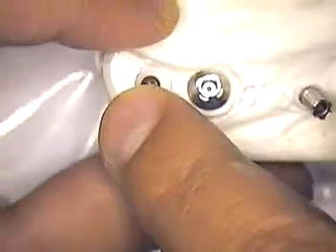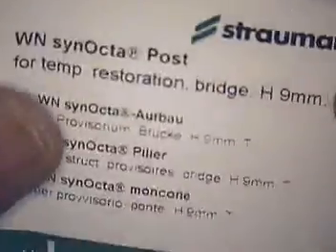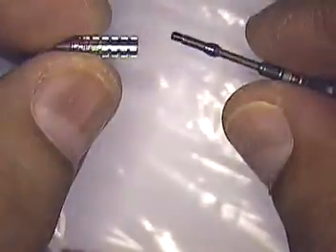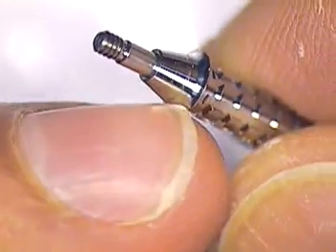I ordered the parts. These are bridge temporary abutments. When you receive your temporary abutments, they come in a container like this. This one happens to be the RC for the bone level temporary abutment for the bridge. I'll also show you the other container — this one is for the wide neck Synokta post, for a bridge as well. When you open the container, you'll get the individual parts. You get a basal screw, and then, very similar to the gold waxing coping that the lab uses to make custom abutments, you'll get this very large flared metal skirt.